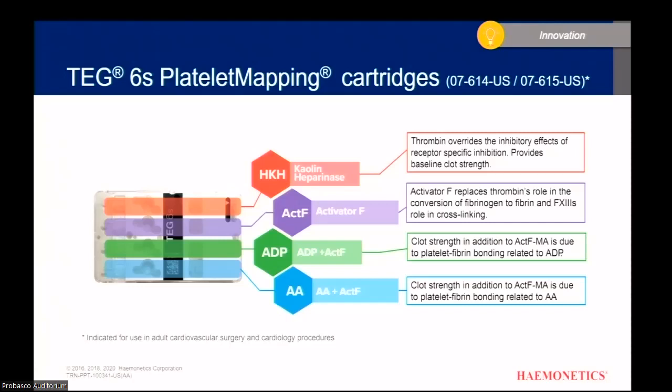So the substitution here is global hemostasis with lysis plus a platelet mapping cartridge. The way they will build it in Epic is a link between the 2 cartridges, so that is what shows up for the patients where you want to evaluate global hemostasis with lysis as well as platelet mapping. There will be an order to select that. There will also be a la carte. So for patients that you do not want to evaluate platelet mapping, you can order that individually.